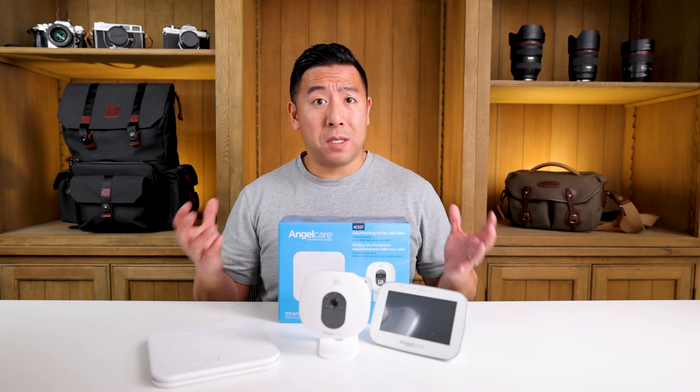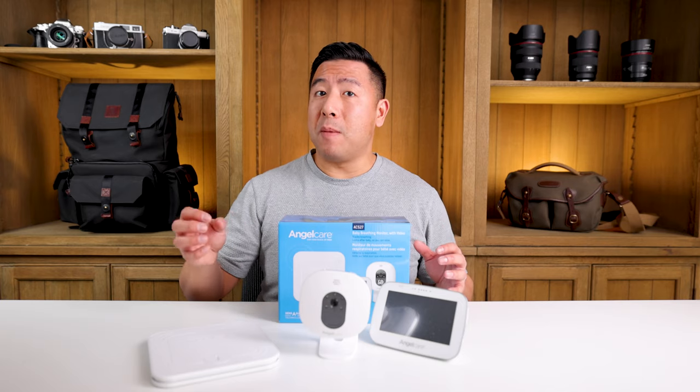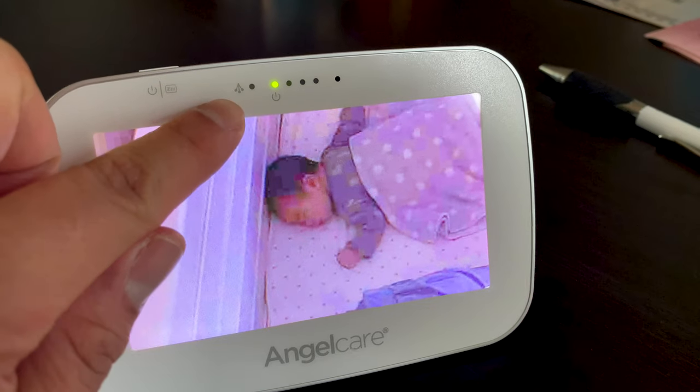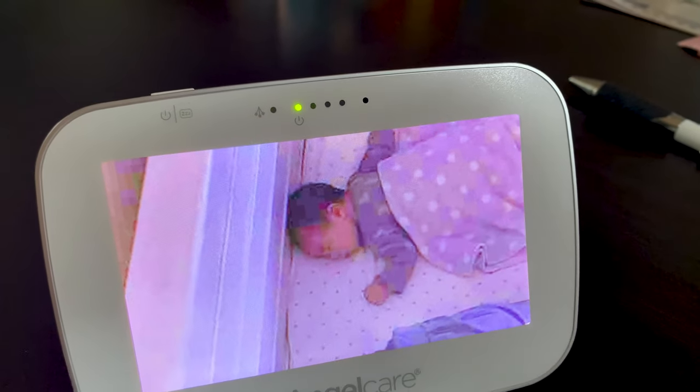So how does this thing work? As soon as you put your baby on there and have everything set up, it senses the baby's breathing motion. You can see it detected on your monitor with a green light — if there's a green light, there is some type of minor motion.